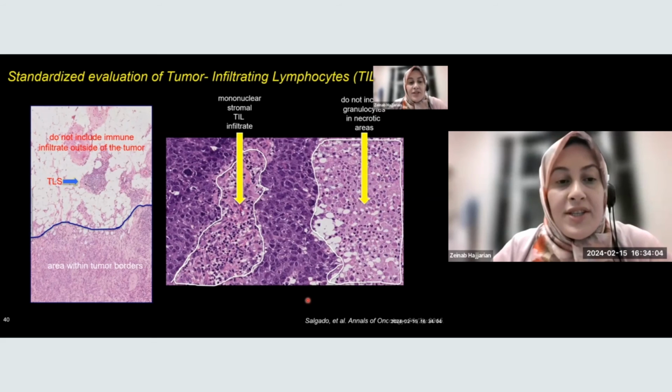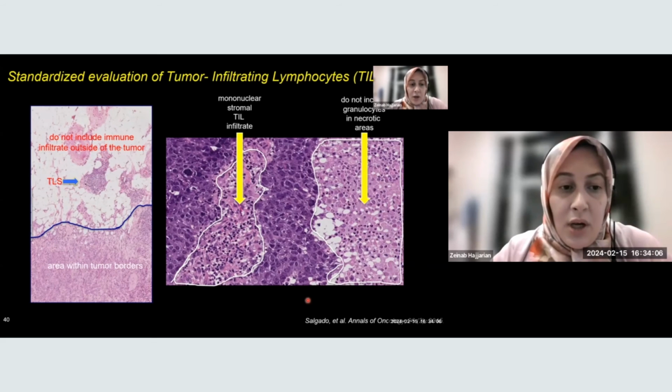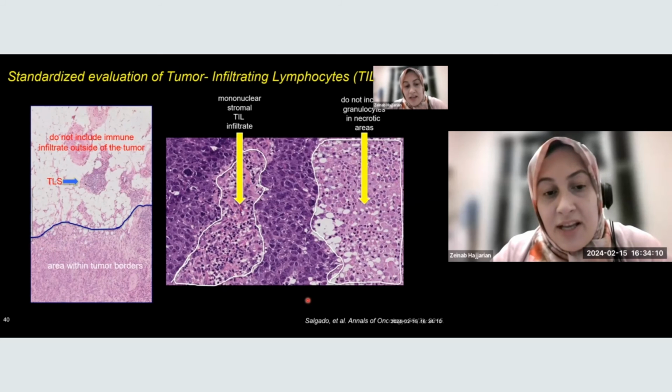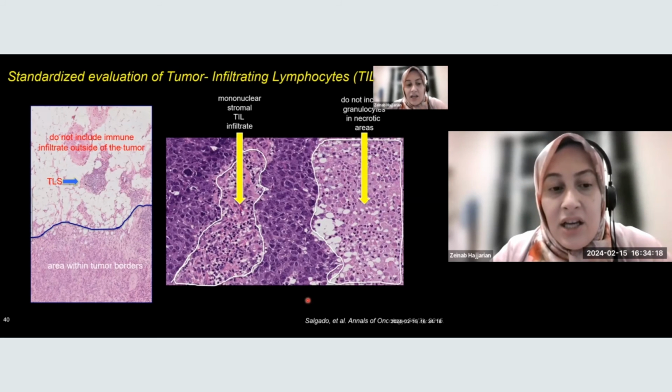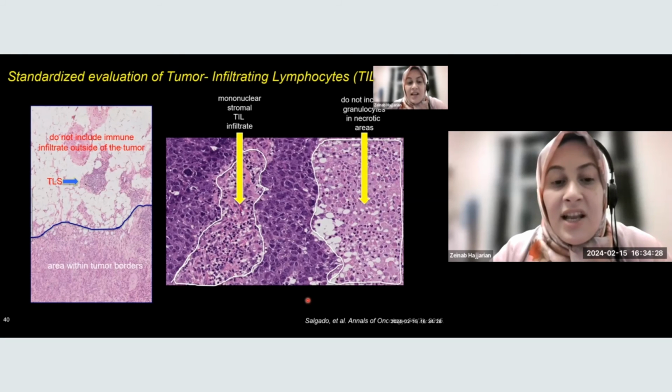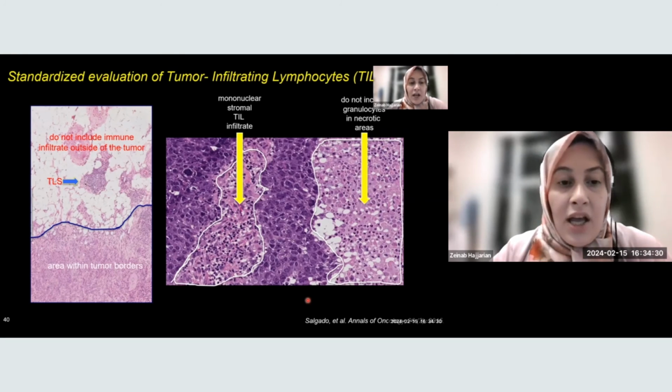The other thing that we looked into: we said, okay, now we have the tumor, we have the co-registered H&E slides. So let's see if we can look into the correlation between stiffness and mechanical properties of the tumor microenvironment and stromal component, all of these micromechanical heterogeneity indices, and the immune response in the tumor. Because honestly, we can look into the H&E slides and identify tumor infiltrating lymphocytes from H&E sections, and there is an effort to assign an immunological grade to the tumors based on that.